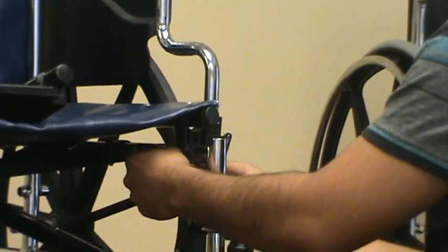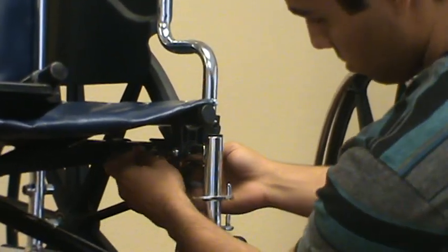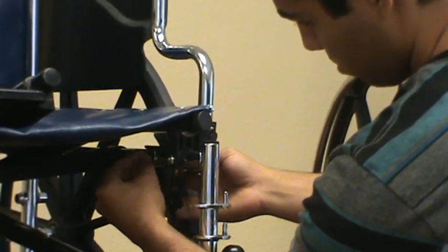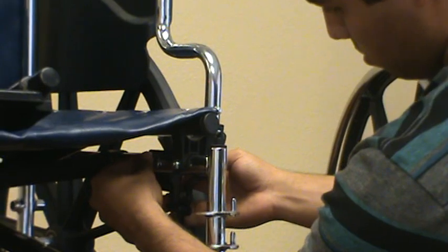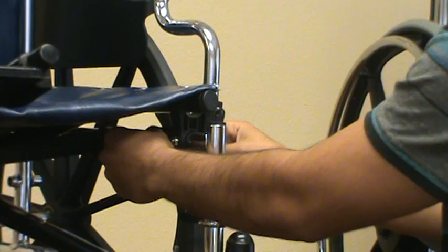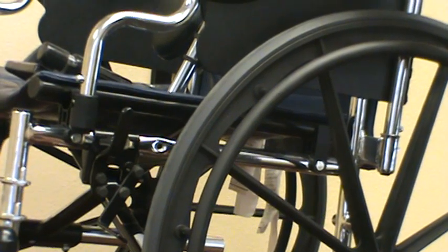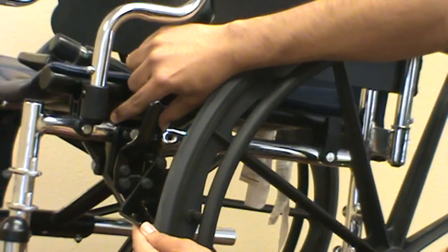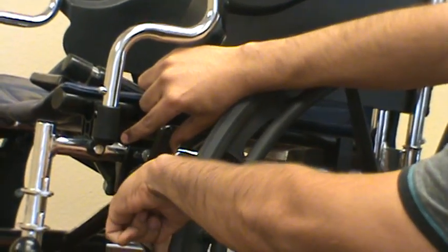To install a new one, you simply put it through the hole and put your washer on. You want to make sure you put your washer on because if you over-tighten the nut it'll crush your pipe if you don't have the washer. Then hand-tighten it, and in the open position slide the wheel lock back towards the tire until it's about a half inch — or a finger's thickness — from the tire.